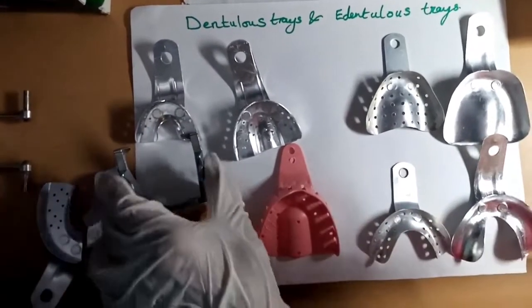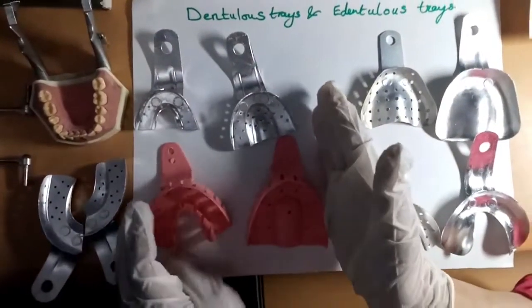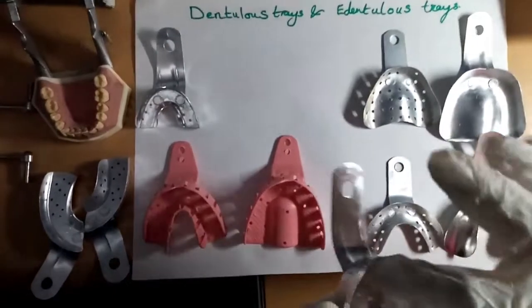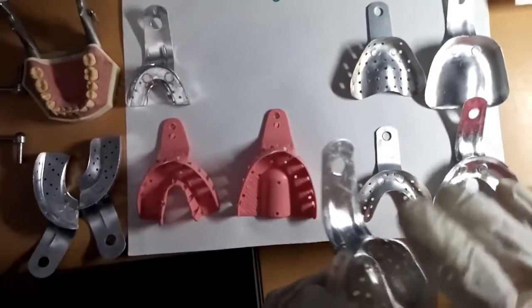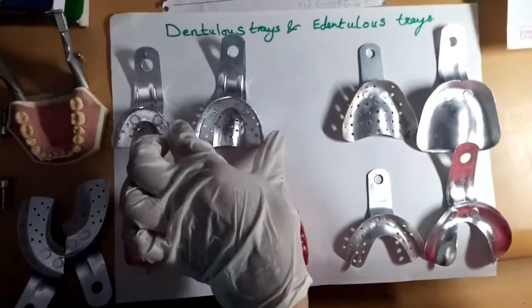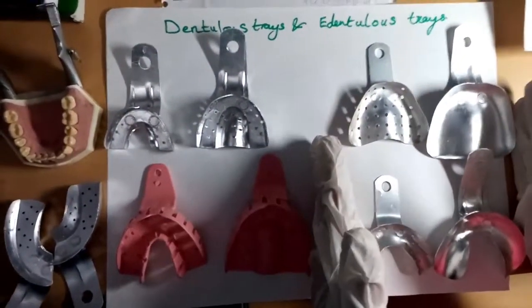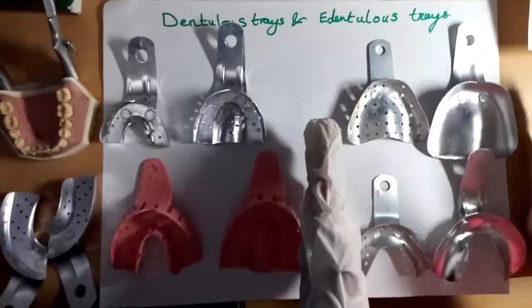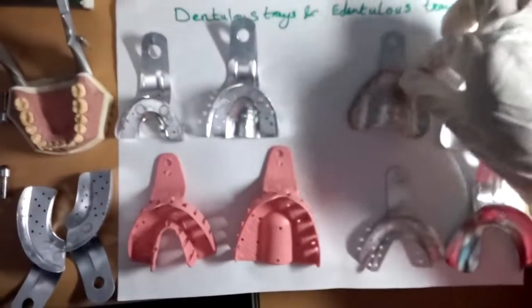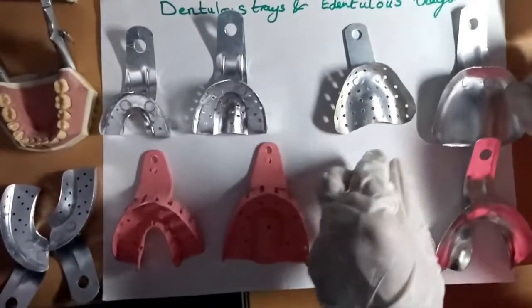Can you see here the difference? These are dentulous impression trays. Can you see this side? This is used for dentulous patients, patients with teeth. Can you see the flange area is a little bit higher than the other one? It's square-like at the end. So this is for dentulous patients with teeth. And this is for edentulous, we call them edentulous trays, and they are used for patients with no teeth. Can you see the flange is much more rounded and shorter?